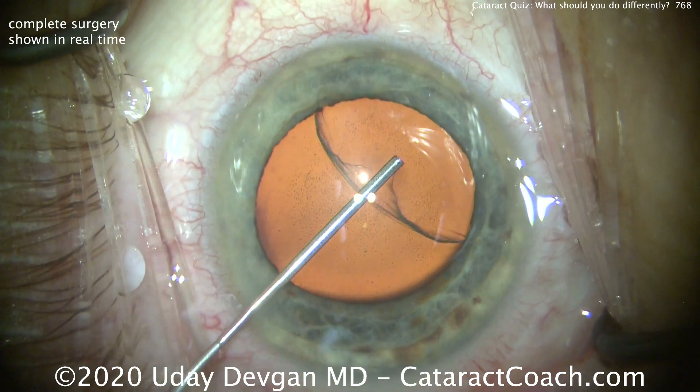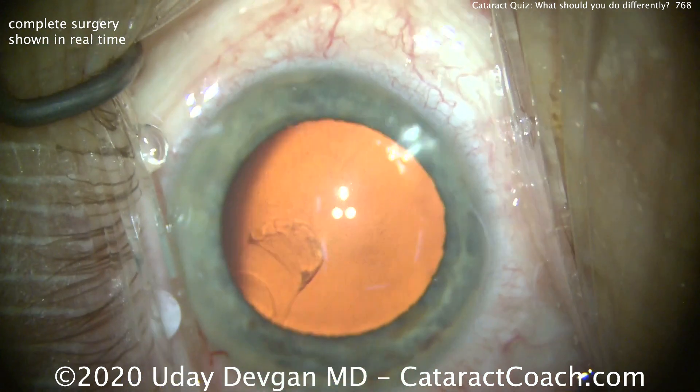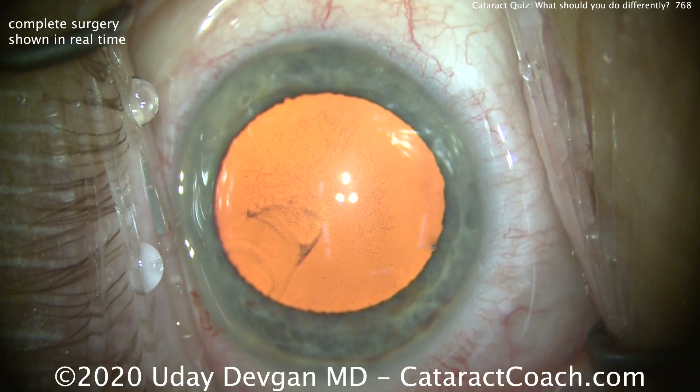There are a lot of things we can do to analyze the eye ahead of time, such as measuring the cornea, pachymetry, endothelial cells, etc. But let's talk about the surgery here.